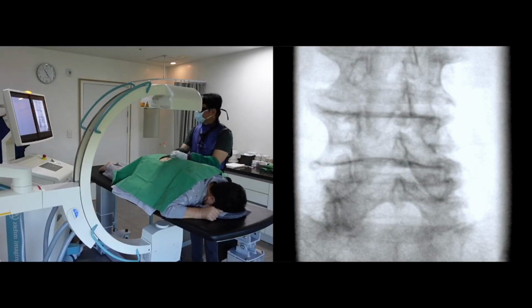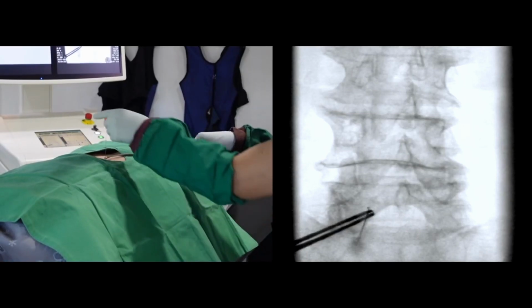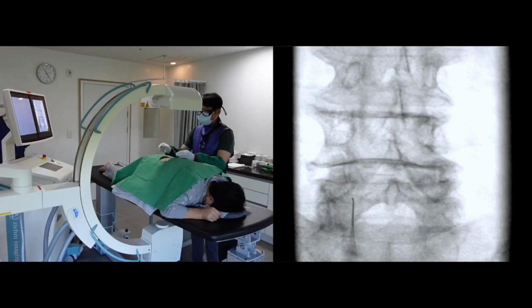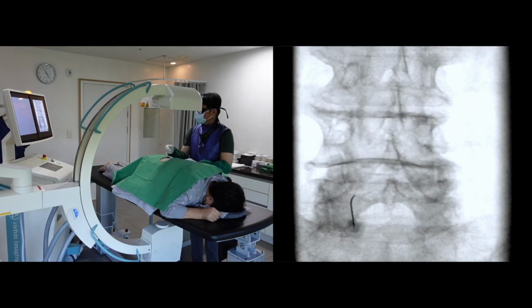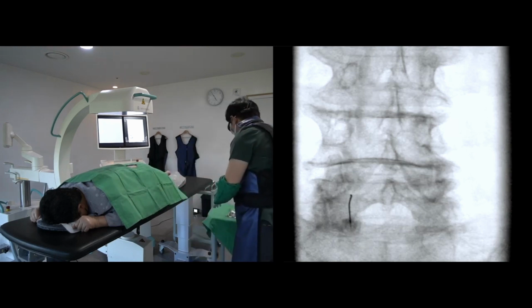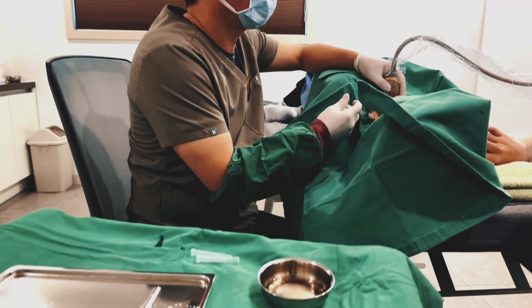enhance patient care. Spinal interventions involve using diagnostic or therapeutic techniques to alleviate and manage spinal pain. These procedures are usually performed under the guidance of imaging technologies such as fluoroscopy to ensure precision and safety. The C-arm fluoroscopy guided procedure has several advantages. It provides real-time visualization of the bony anatomy and needle, making it an accurate strategy for spinal intervention.